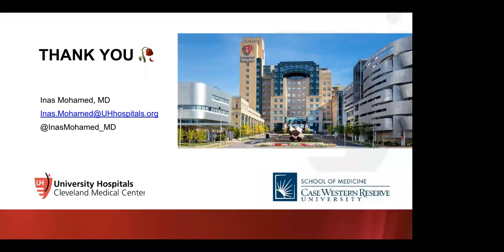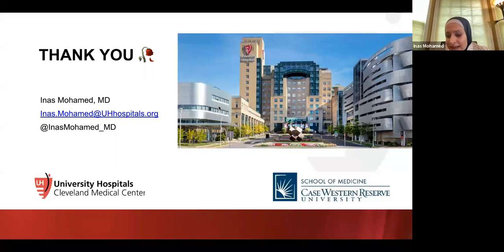Is there a reference for training for LIRADS? Because it's more difficult to use the lexicon, not the final LIRADS. Mass, observation. Quite frankly, I can just use the word lesion, in general. I know in the paper they are all talking about observation. This is like an oncologist word, but I usually say a lesion. In my impression, the way I say it, 5 centimeter LIRADS 5 in segment. We all understand what I'm talking about. I don't have to say more than that.